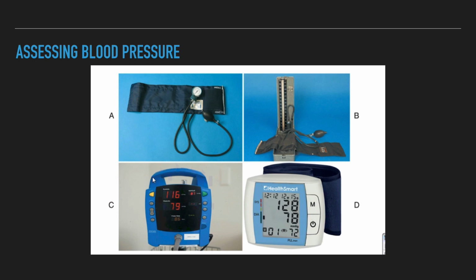These routine checks of manometer function should be made throughout the range of pressure measurement to ensure the device's accuracy. Aneroid manometers with a stop peg at the 0 point or an external reset are not recommended because verifying the accuracy of the manometer is impossible. Mercury manometers consist of a vertical glass tube marked in 2 mm increments.